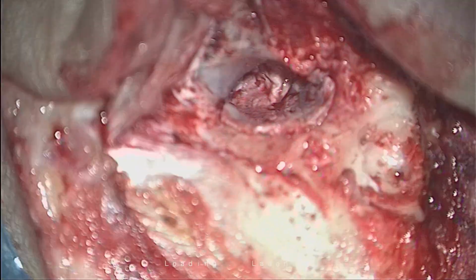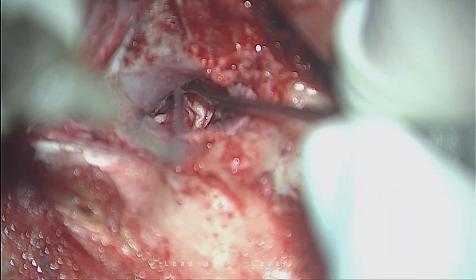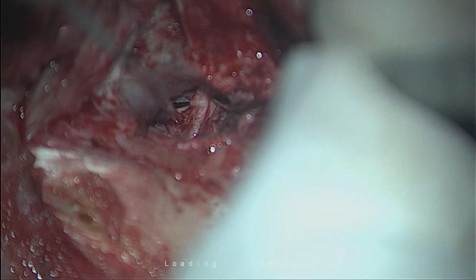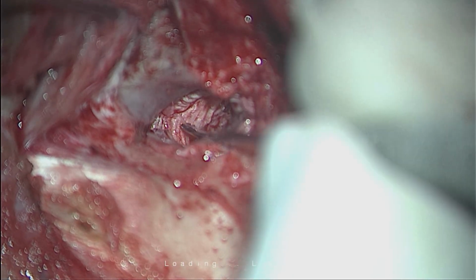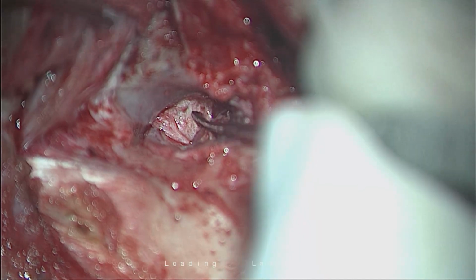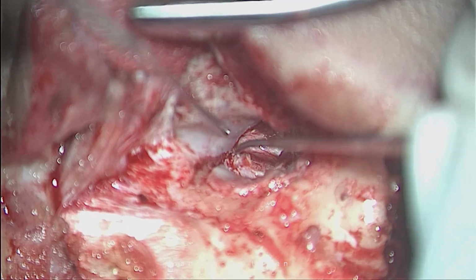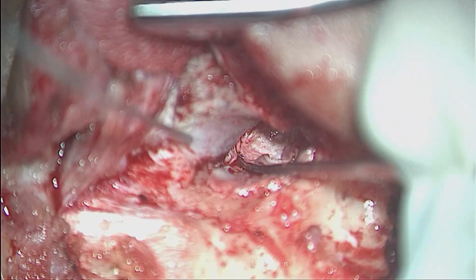This is the second part, and in this I elevate whatever graft we have pushed. See this? I will elevate it over the mucosa. The simplest: the first part is advancing into the middle ear. Second part is the posterior part joining with the flap, and the rest of the fascia is placed over the mucosa. Why this posterior part joining the flap? So the graft is not displaced posteriorly.